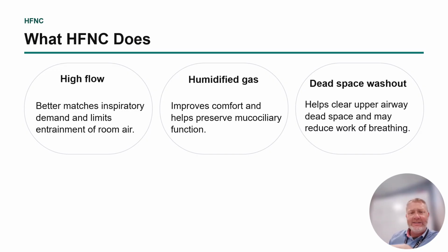So one thing you may see, and this is kind of a little segue, you may see the Salter high flows, Salter being a brand. They're green. They look like just a big old large bore nasal cannula that you turn the flow up a little bit higher, so you can go to like 10 to 15 on the flow. Do not mistake those for being true high flow devices because in most cases they are not. They're just a little better than a low flow nasal cannula for people who need a little more oxygen. Those came out during COVID when high flows were scarce, and they do serve a purpose.